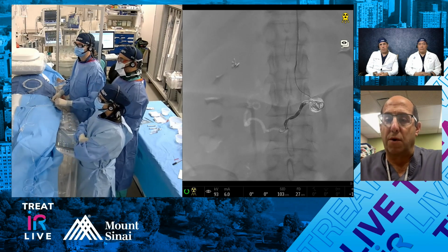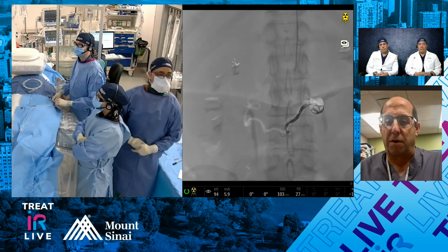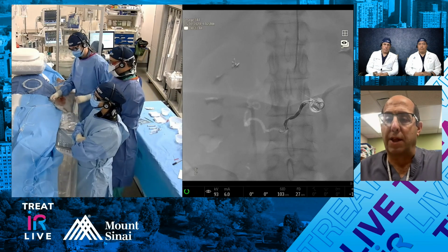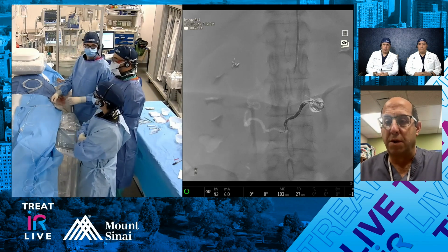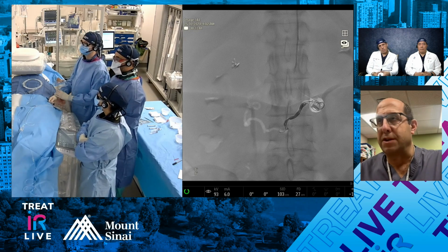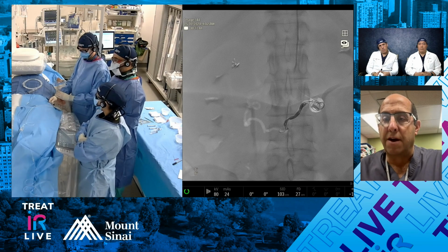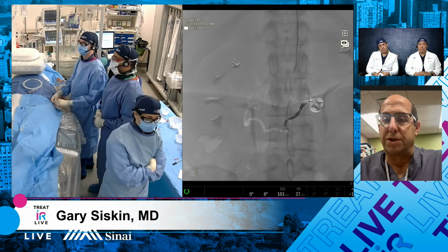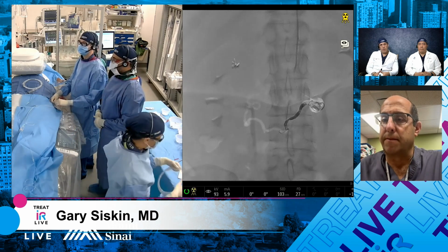So I think it works, and I think as a platform, you have your packing coil, in addition to a routine fibered coil, as well as a softer coil, maybe for spaces where you want to avoid catheter kickback or anything like that. So if you're used to this coil, there's a whole platform to meet a variety of circumstances.